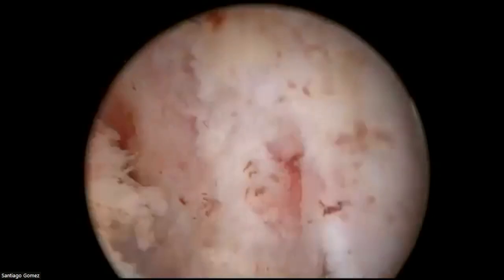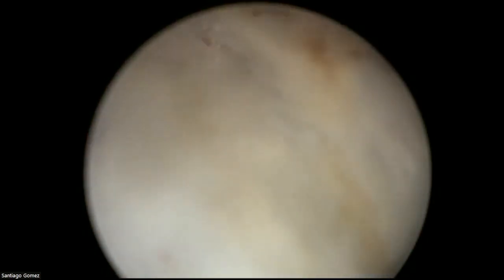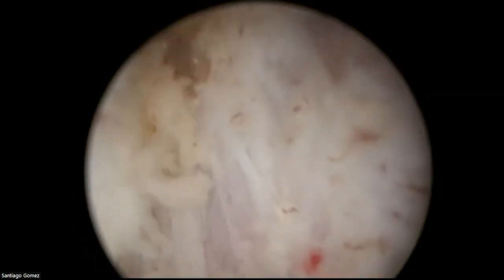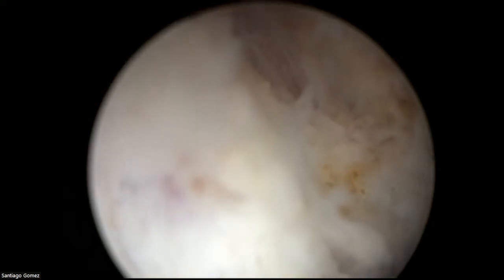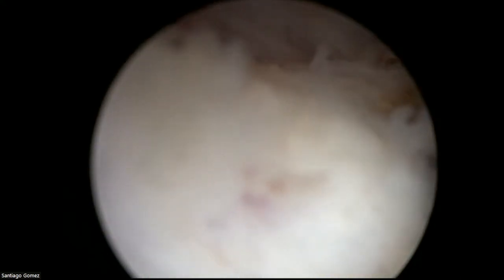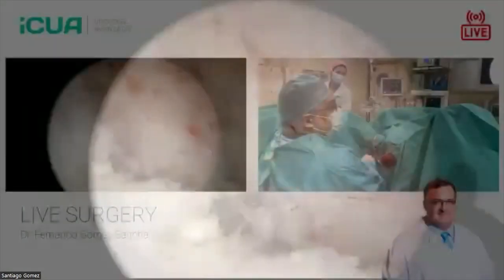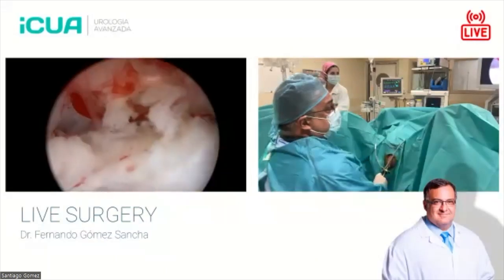And then of course, when things get a little bit tricky or difficult, just relax. Try to make small advancements, small improvements. Sorry, I broke the fiber in my hand. This is not common, but sometimes it can happen. I don't know why. There we are. This is fiber again coming in.